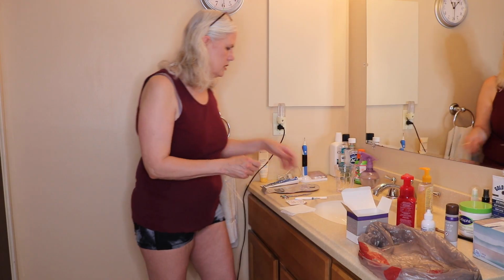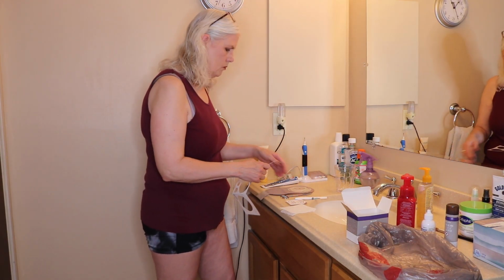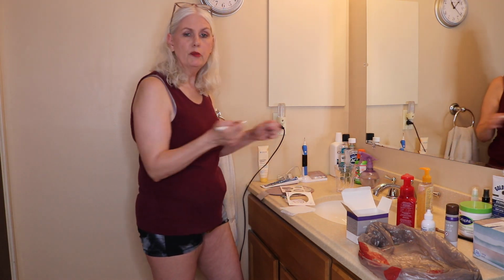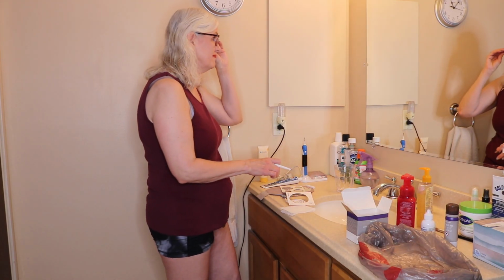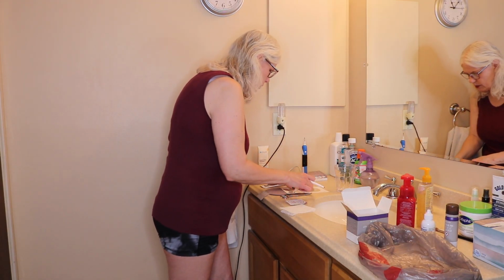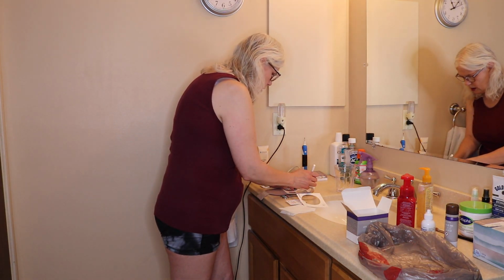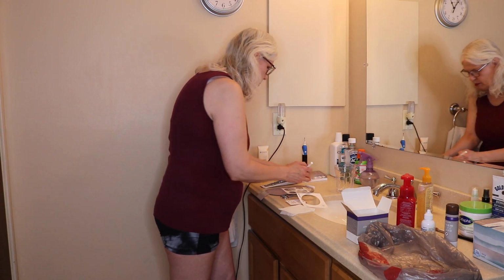So depending on the type of bags that you use and all that kind of stuff, and cutting your hole, you may or may not need some of these supplies, but I am going to put my glasses on. Hopefully I won't have my glasses reflect too much in the video, but there we go, the 1-inch mark. Start my process.